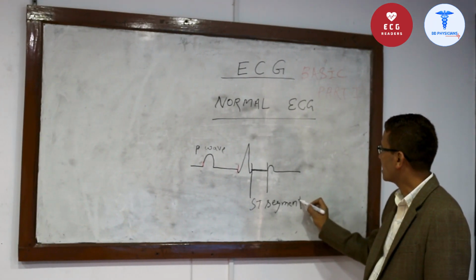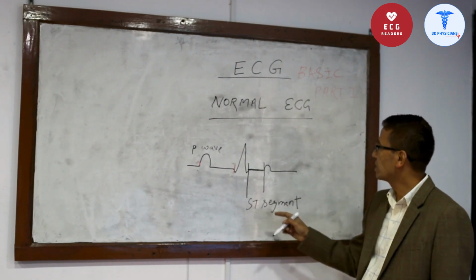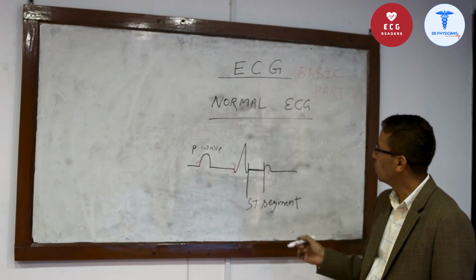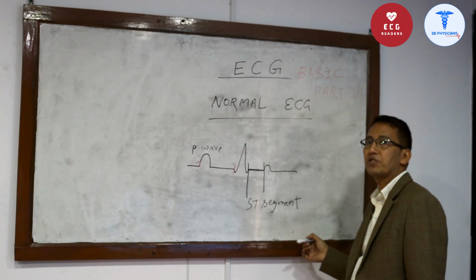During this ST segment, there is no conduction of the electrical activity from the atrium to the ventricles.